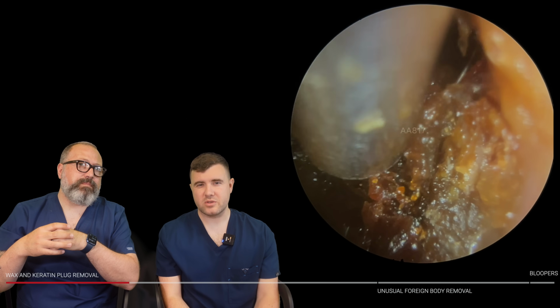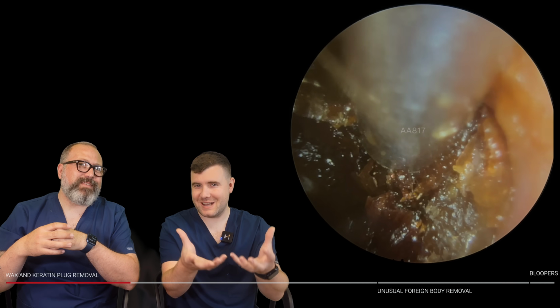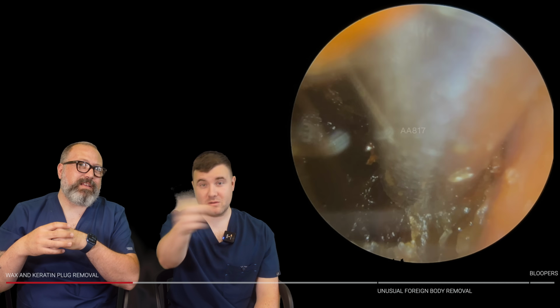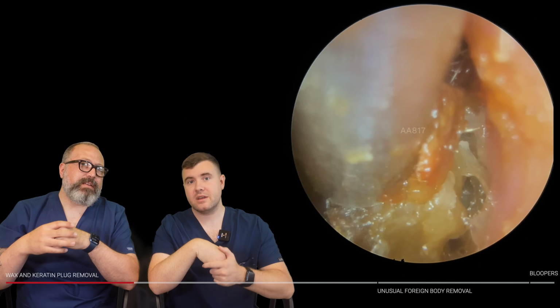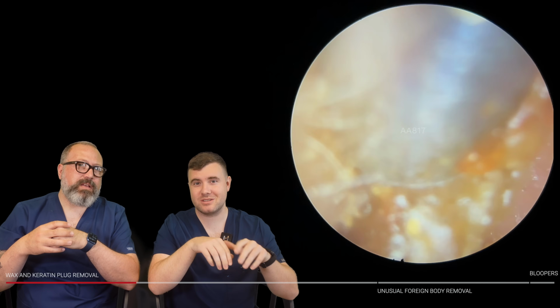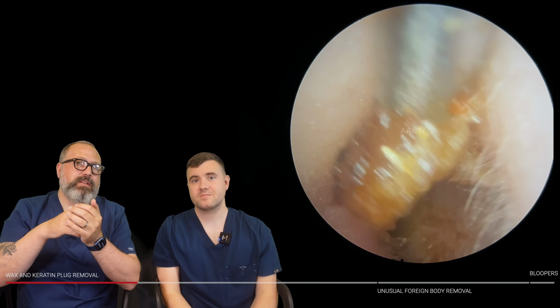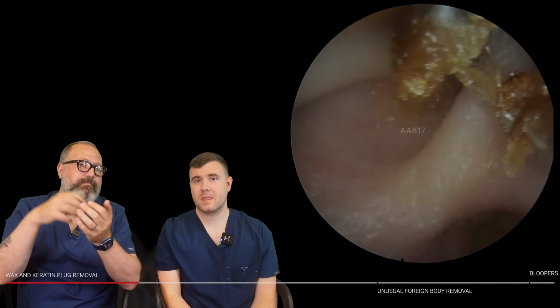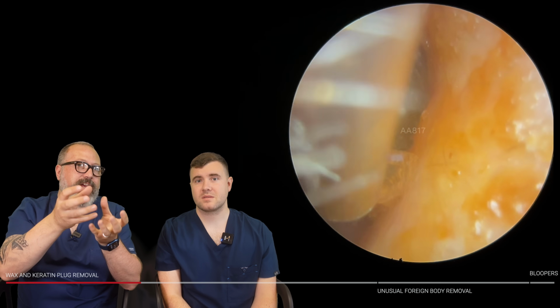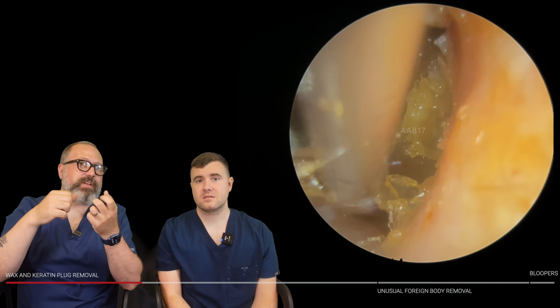You just hope you start seeing the whole plug starting to move forwards. Yeah. And you're pulling on this little bit, you can just see in the bottom corner, or on the other side of your screen, sorry. It's just not moving at all. No. It's literally just coming away in sections. And what you'll tend to find is you take it like a punch, like a melon ball almost. So you drop it onto that softer wax, and it'll take a circular section and pull that away. But you're not taking a tremendous amount away.